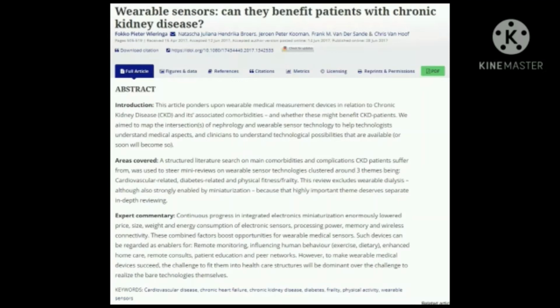Applicable to all three clusters are: first, extra attention for risk analysis. For any medical device, risk assessment is mandatory, but for a wearable device intended for use in daily life, the risk assessment must cover a wider variety of scenarios. The IEC safety standard on medical devices for home use explicitly lists many points of attention for wearables. IEC terms them body-worn devices.